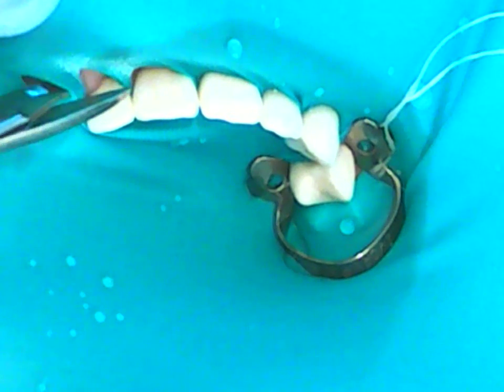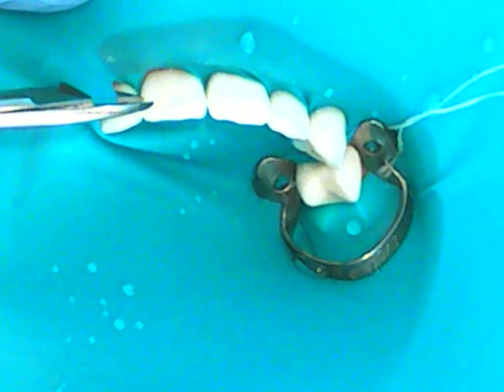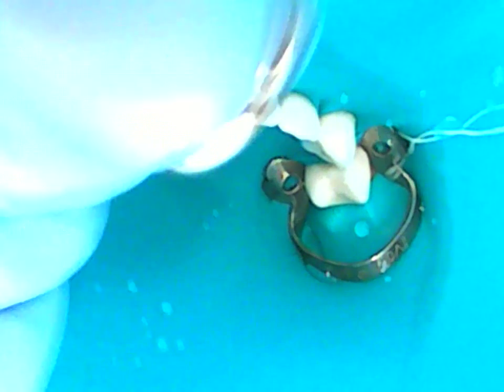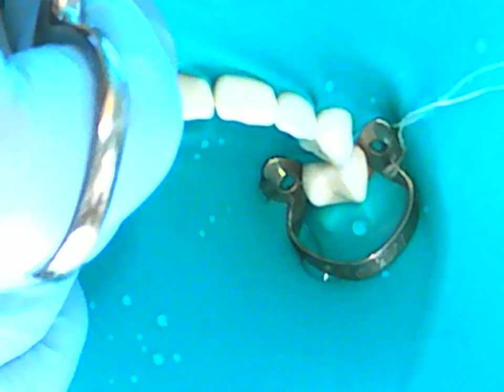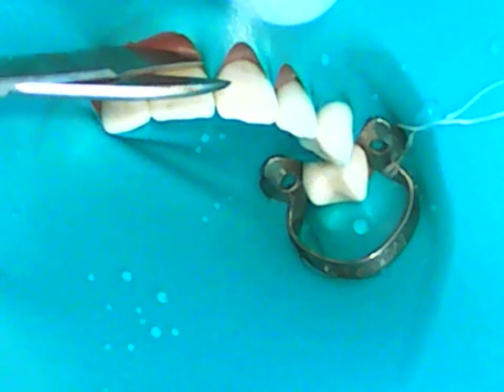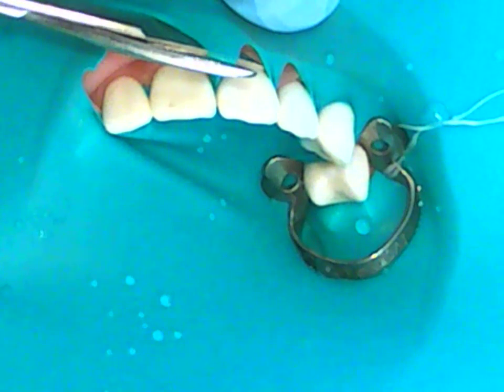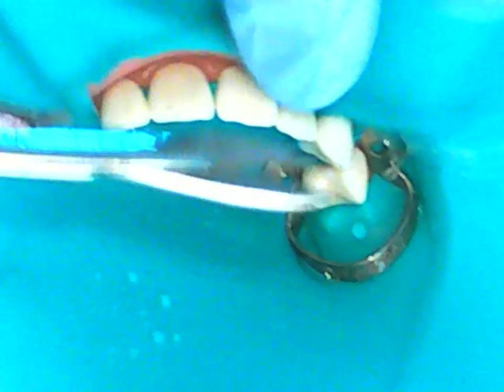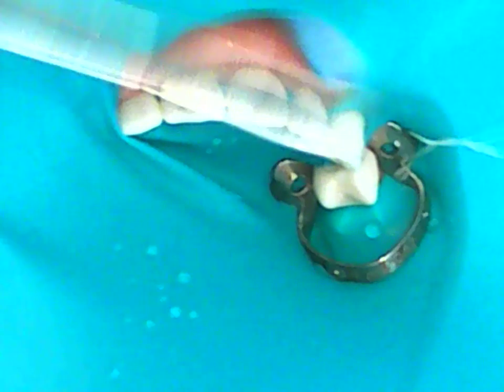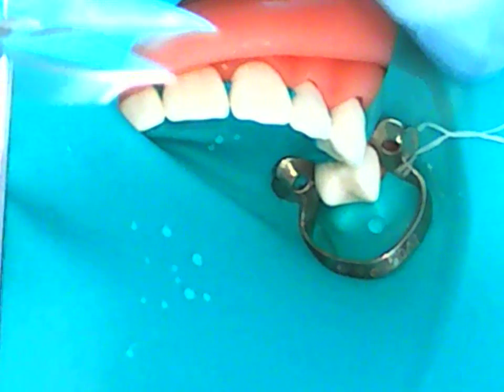Okay, again, you're stretching each septum. Make sure you have the scissors completely around each septum prior to cutting, and it's ready to cut. Okay, you may need to work with the lip a little bit to try to get under there properly. Okay, stretch, cut. Stretch. When you can see the beaks of your scissors, you know that you're not cutting the lip then. Right, so that's another important aspect. Not only is it a nice clean cut for your septa, but you want to ensure that you're not injuring your client with your scissors. And I maintain the horizontal position with my scissors throughout.